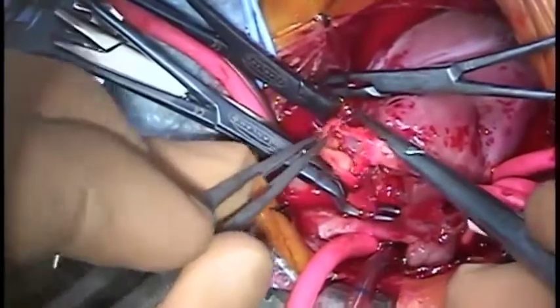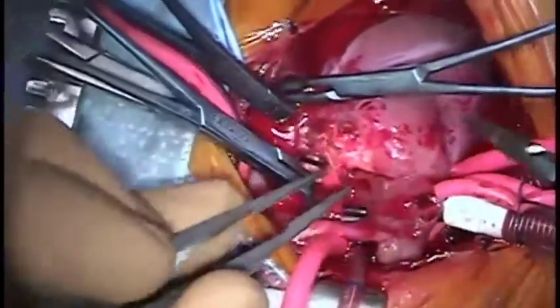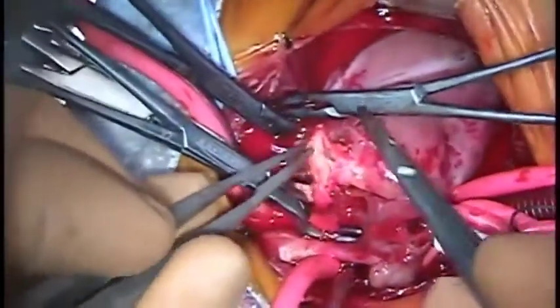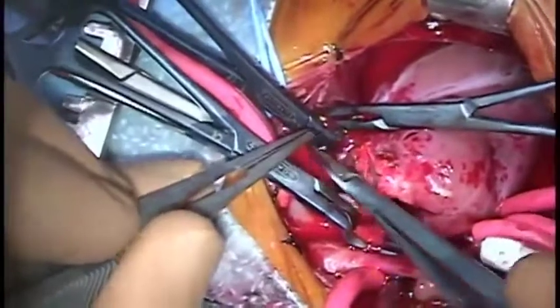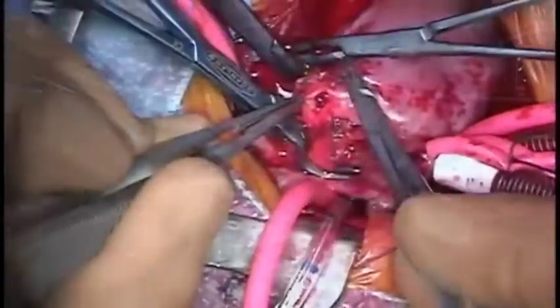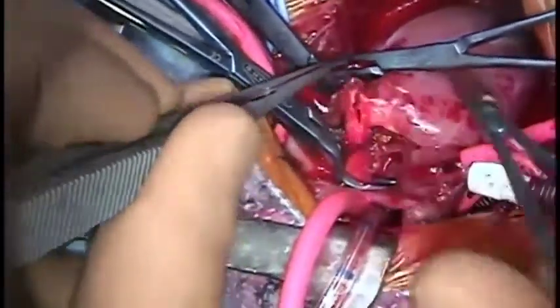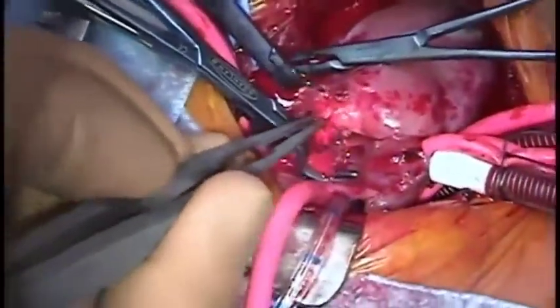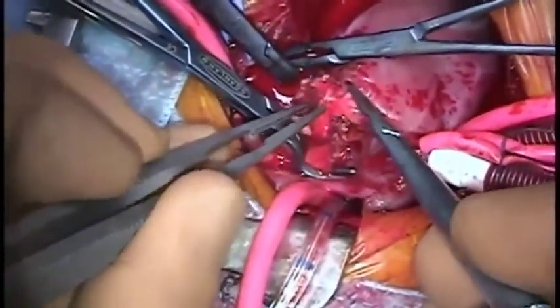Both sides of the anastomosis are now the same length, allowing the suture line to be completed. Because both tissues being anastomosed have the same elasticity and the shape of the anastomosis is not complex, it is not necessary to balance the shape and tension by switching sutures.